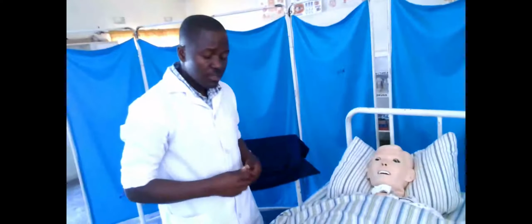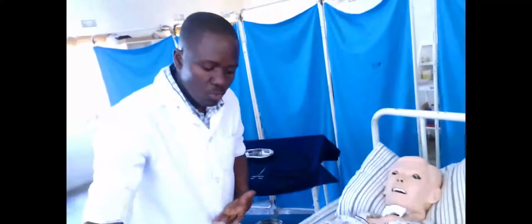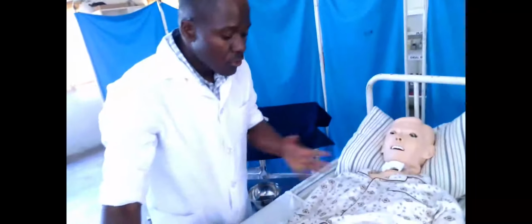So Mr. Miller here, I start by greeting. Good afternoon, Mr. Miller. Good afternoon. Mr. Miller, I am Silwamba Collins. I've come to clean your colostomy. Can I please check how it's looking? I said yes. So then I have a look. Before I touch it, Mr. Miller, are you going to allow me to go on with the procedure and clean it? I said yes. Okay, so let me just leave it exposed for a minute, then I come back.